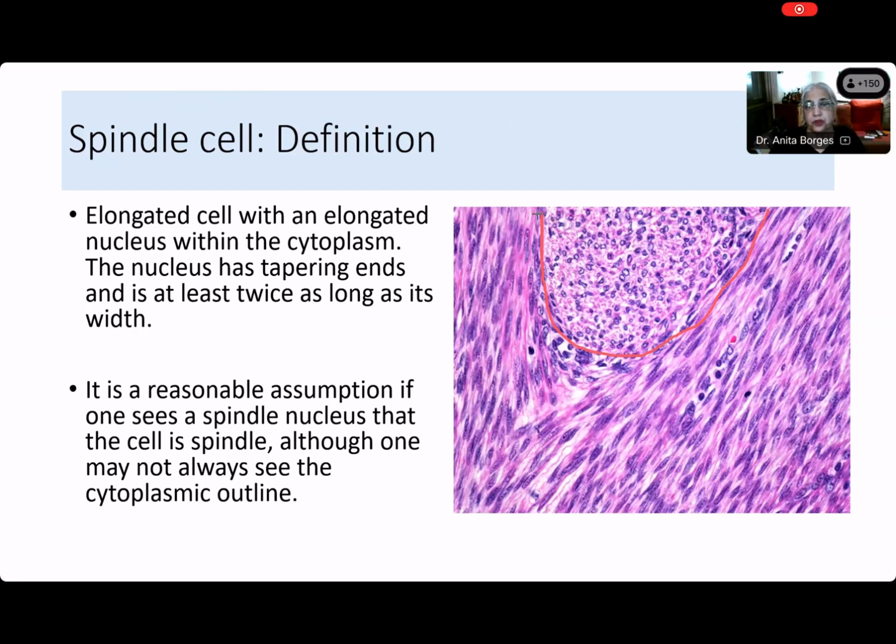What is this that you are seeing? I have outlined it, and I'm doing it again so that nobody has any doubts about what Shashank is talking about. Yes, ma'am. So now, are these spindle cells, Shashank? The answer is very simple: yes or no. Are these spindle cells? Ma'am, boundaries. You're talking about boundaries. Now I'm talking about whatever cells are within this red and white region that I have drawn. Are those spindle cells? Shashank, the answer should be simple. It's either yes or no. So what do you want to say?